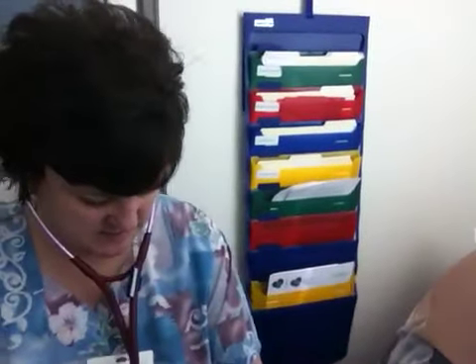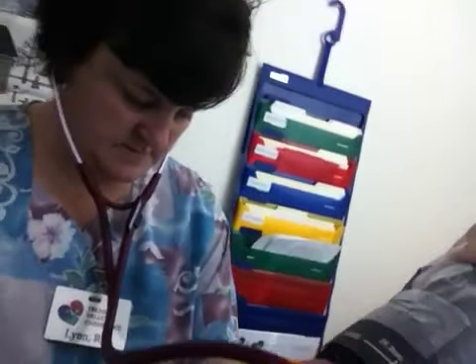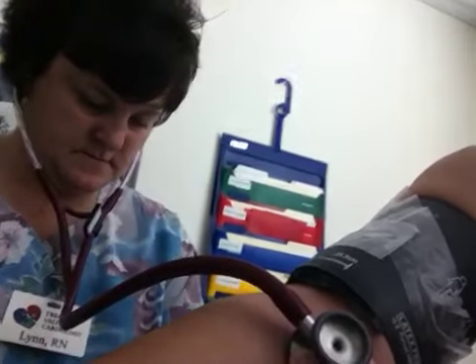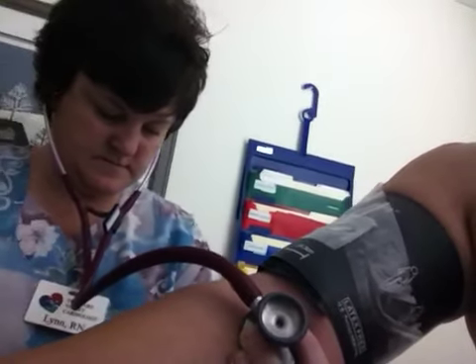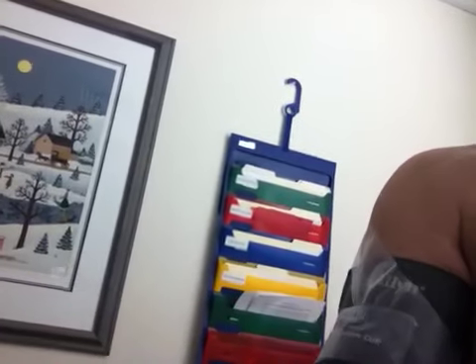So what are we doing here? We're taking your blood pressure to make sure that after your stress test everything comes back to normal. 152 over 82. That's a pretty fast recovery.